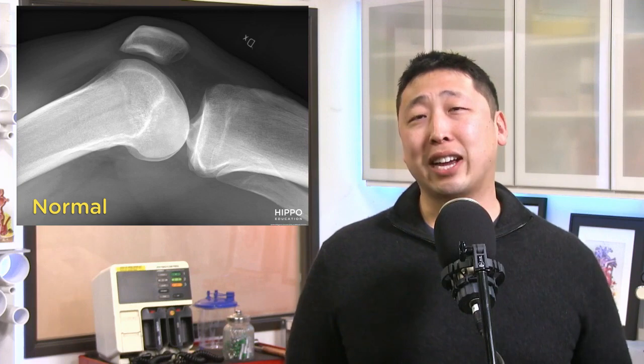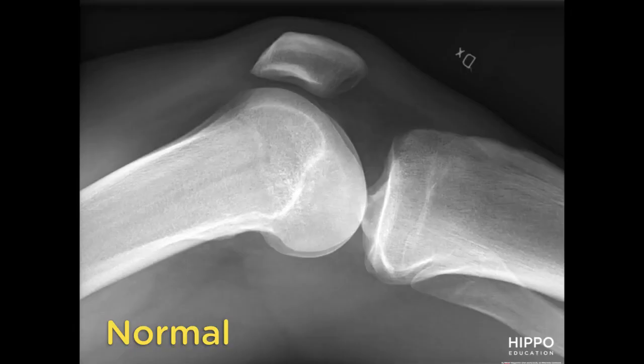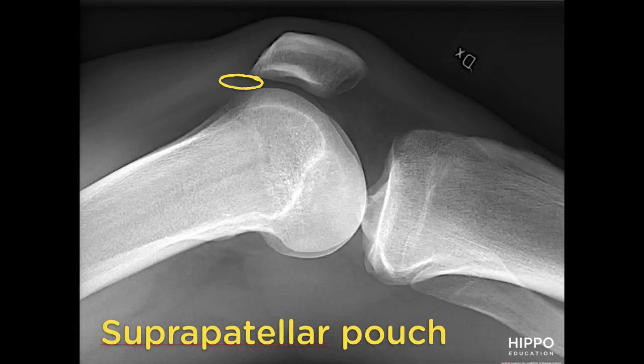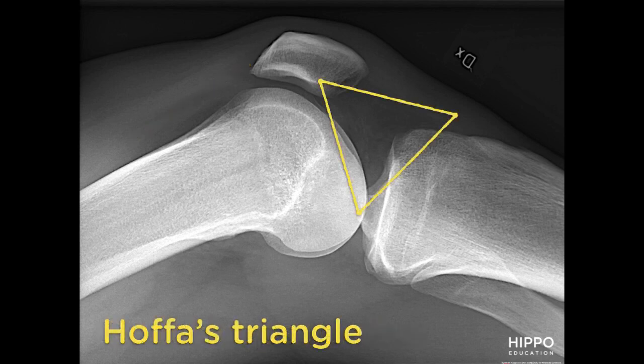This is a normal lateral knee x-ray. There are four main structures to note. First is the suprapatellar pouch — in a normal knee, the suprapatellar pouch is not prominent. Second, you can see that the quadriceps tendon is straight and the posterior border of the quadriceps tendon is clearly defined and not blurred in a normal knee x-ray. Third, Hoffa's triangle, or the area around the anterior femoral condyles, in a normal knee is radiolucent or dark.